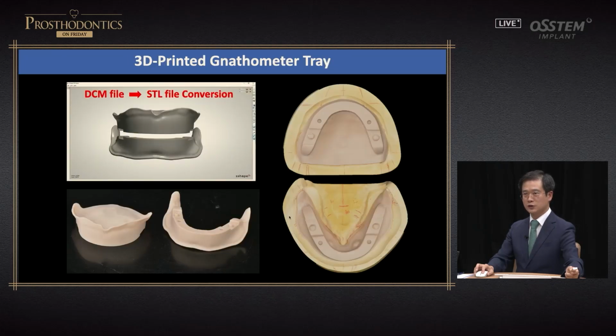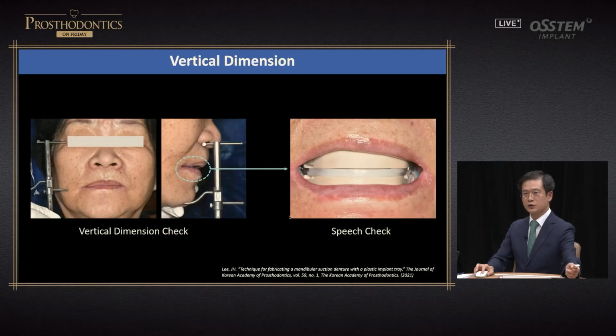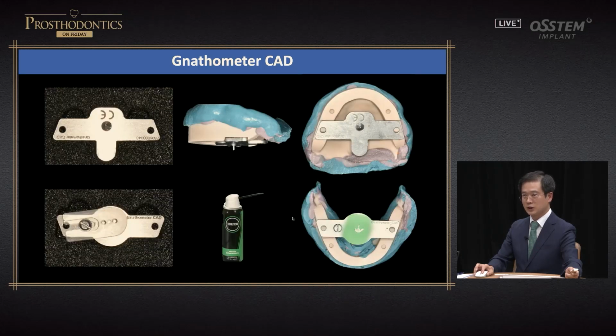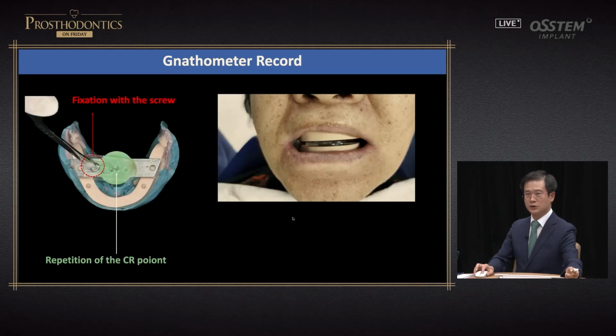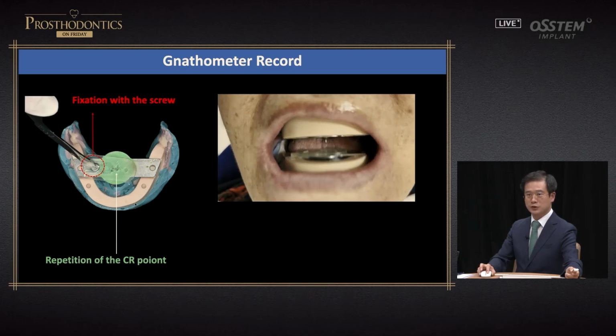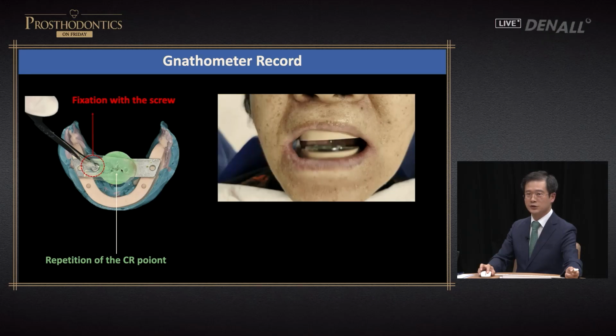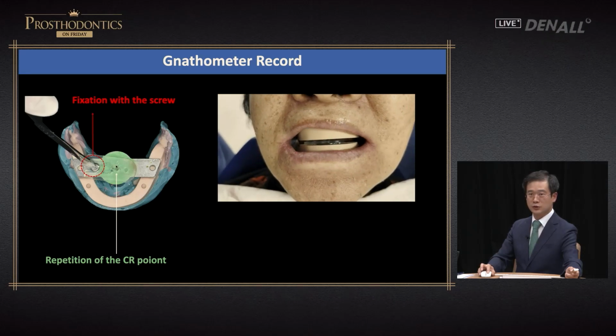And an impression tray for when the patient is closing his or her mouth is made. Gothic arch tracing appliance. This is used to get a CR guide bite. As you can see, the Gothic arch is the easiest way for beginners to take CR bite.